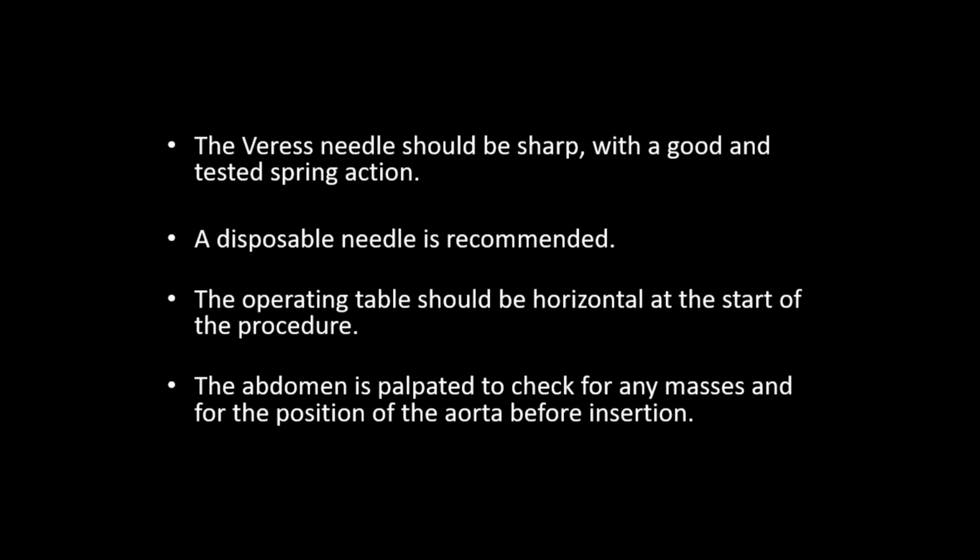Okay. Then the Palmer's point will be ideal in some conditions with expected extensive pelvic adhesions. Unfortunately, it's not regularly used in our practice, and sometimes most of our consultants are not experienced enough in using Palmer's point, although it's recommended by the guideline.